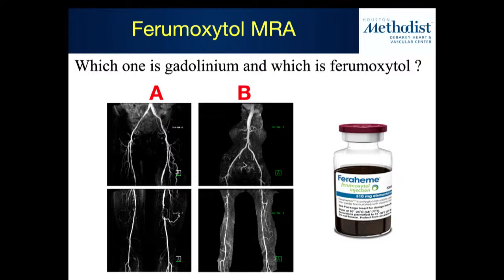So again, for vascular imaging, this iron-based agent works really well, but it doesn't work for scar imaging because the properties of it are such that it's not going to concentrate in areas of infarct or scar.